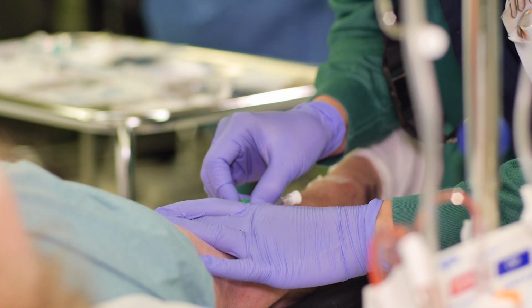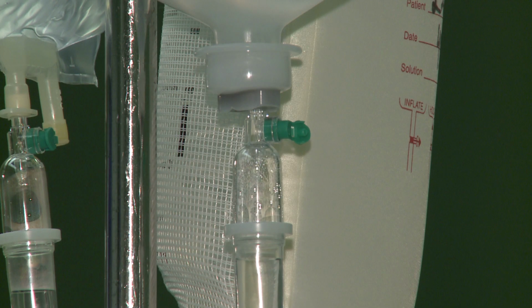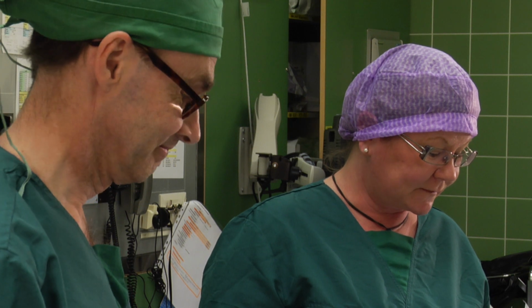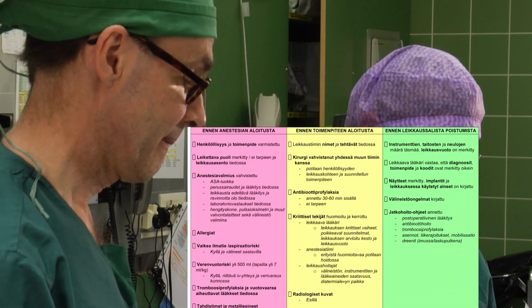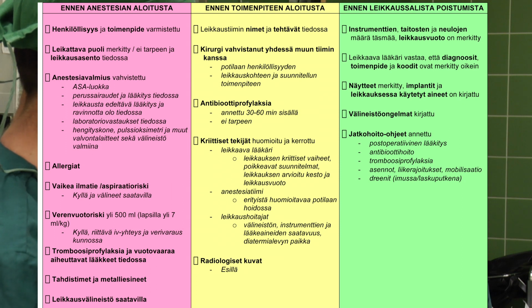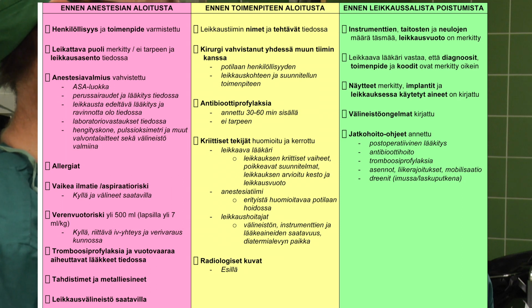An intravenous cannula is inserted to gain access to the systemic circulation and to allow correct hydration by administration of intravenous fluids. The World Health Organization pre-operative checklist is read by the staff of the operating theatre. This checklist has been developed to improve the patient's safety, and the list is read before every anaesthesia or any other procedure. The patient's notes, particularly with reference to their previous medical history, medication, allergies, and fasting status, are double-checked.